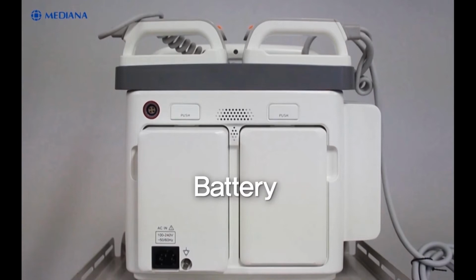Finally, for the battery use, D500 has the rechargeable battery that can be used to power D500 when AC power source or external DC-DC adapter is not available. The battery status icon appears on the screen when D500 is on battery.